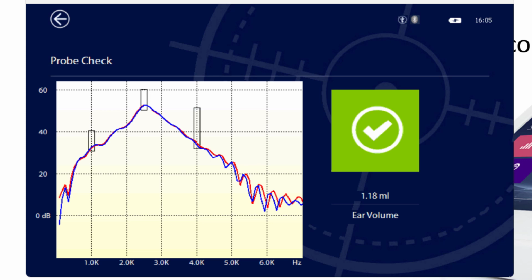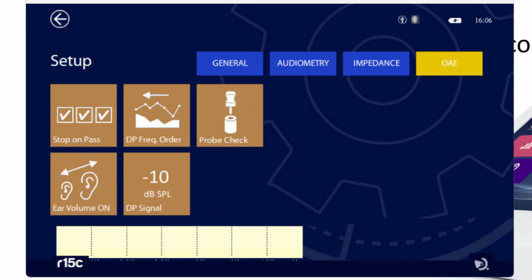Now, if you don't know how to clean it, the cap that is on the probe needs to be pressed onto the rest of the housing, and then you turn so that you align the two dots that are on the probe, and then it comes apart. You can then clean the tip, and then afterwards you need to mount and press it again and turn it again.